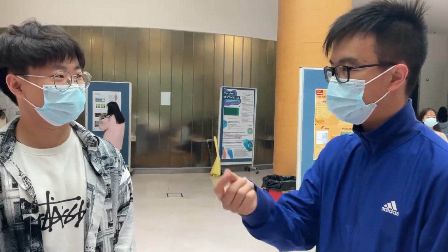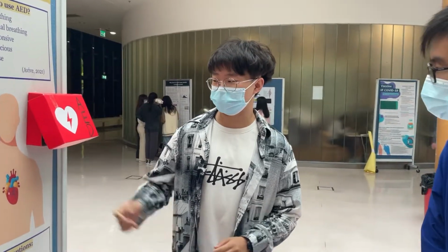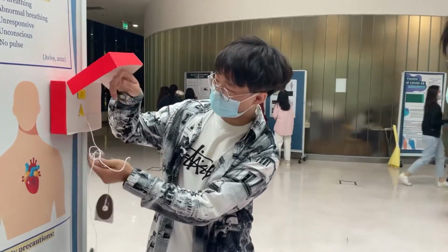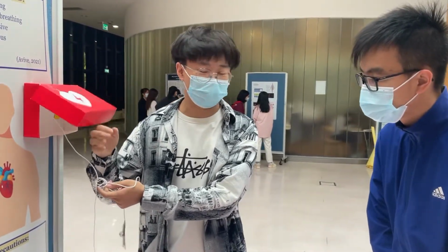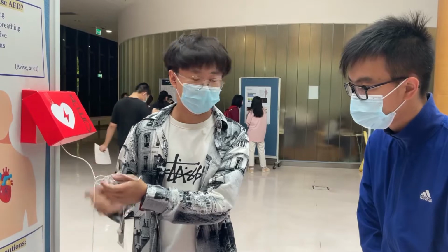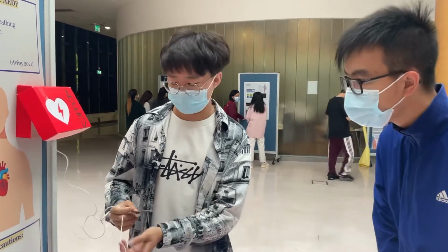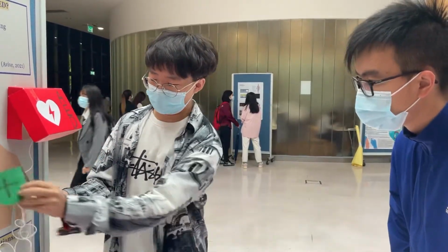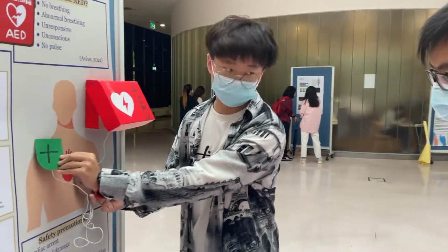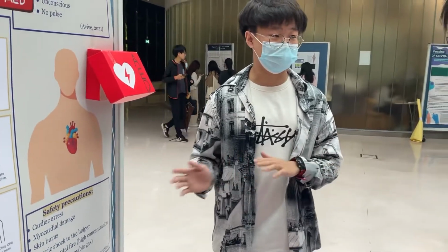Thank you. How to use this AED? Actually, it is very easy to use. The first step is to open the box, and you can see there is a power button. Push the power button, and the AED will give you the information on how to use it. The next step is to take off the clothes of the patient and apply the two electrodes. One is positive and one is negative. Apply them to the patient like this. The next step is to make sure everyone is clear and no one is touching the patient.